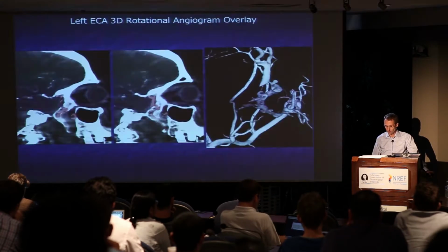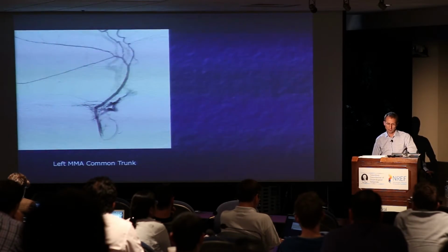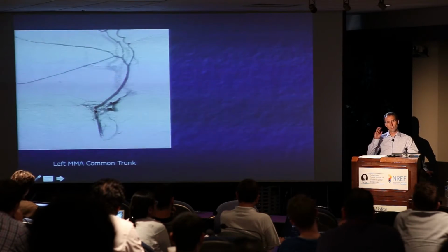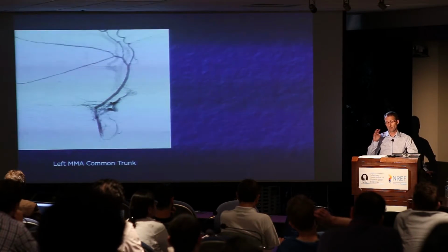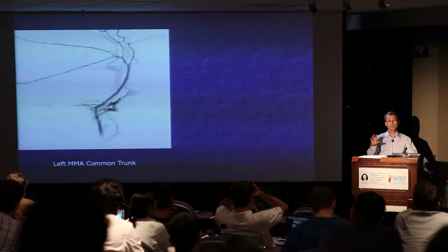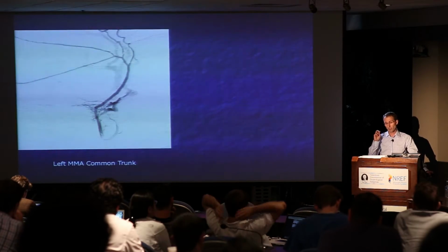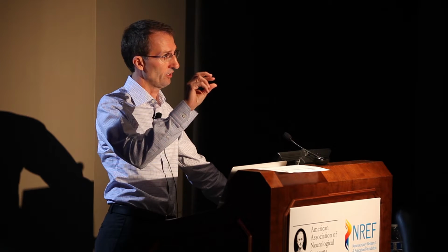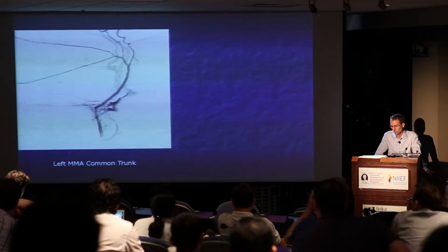For that, I unfortunately don't have the entire angiographic run here. So you have to look in the earliest frames. I do this like you're filming an AVM, so I do this on fast filming, as fast as possible. You want to look as early as possible in the angiographic run to see where the fistula actually forms, and then you can see what the actual outflow of the fistula is. My next case, if I can get to it, has a better example of that. But you can show them that. Just on that picture, show them.